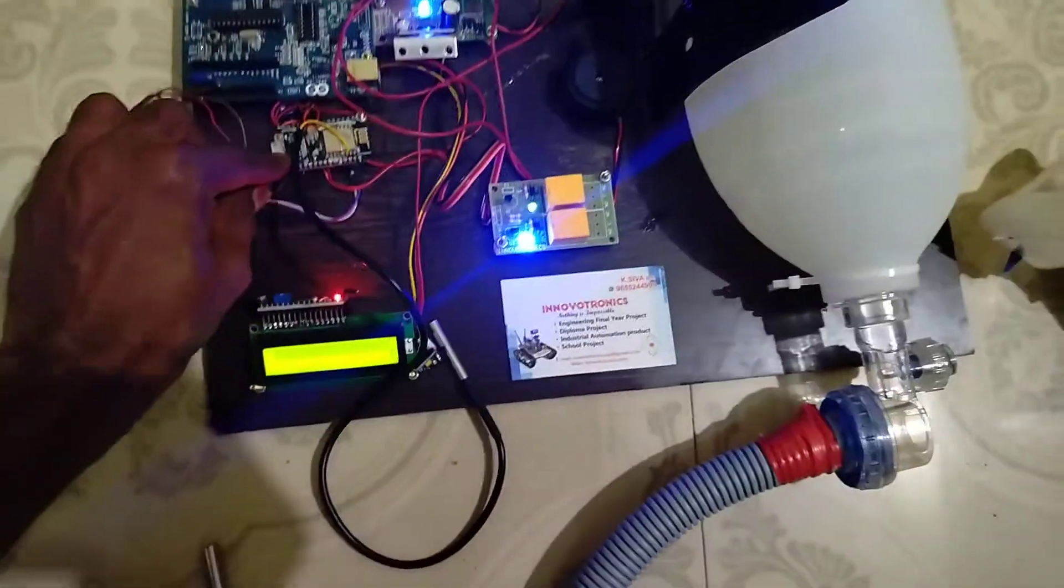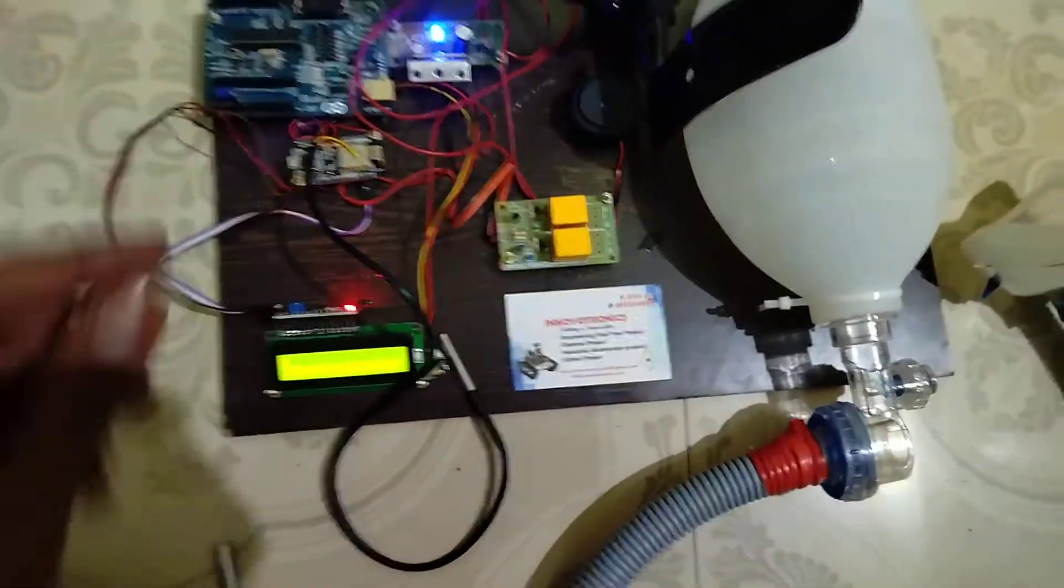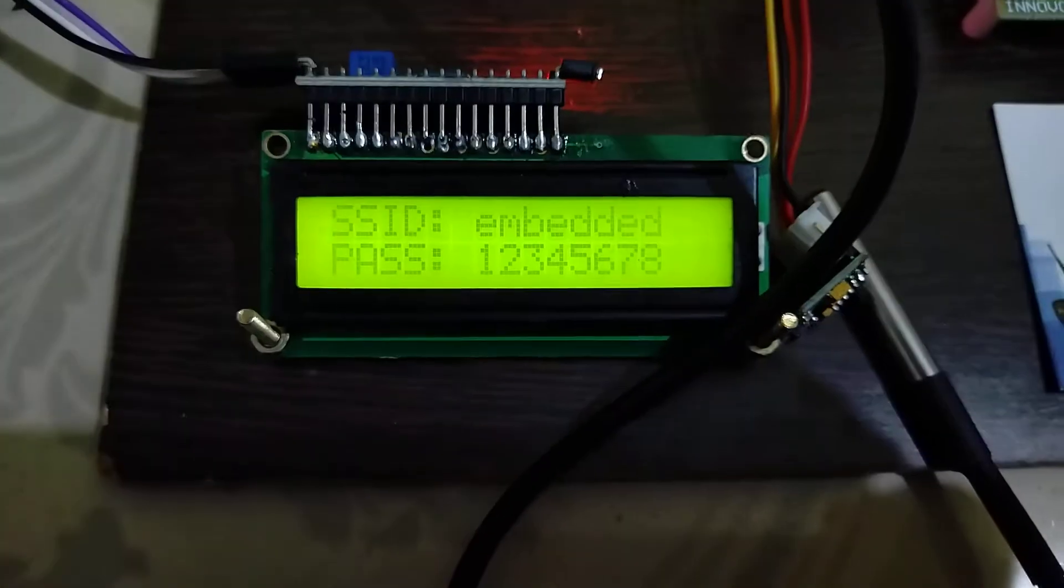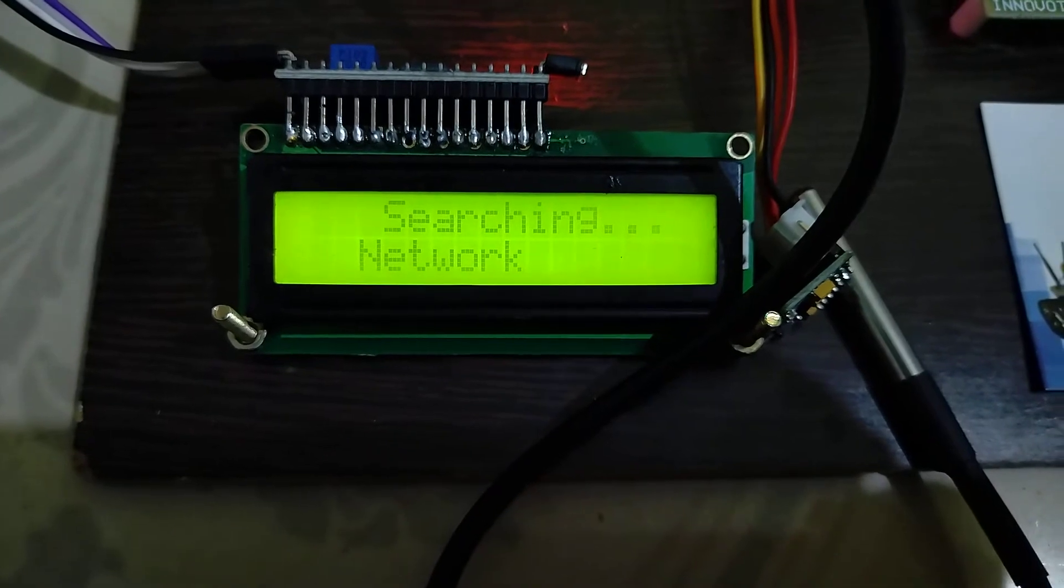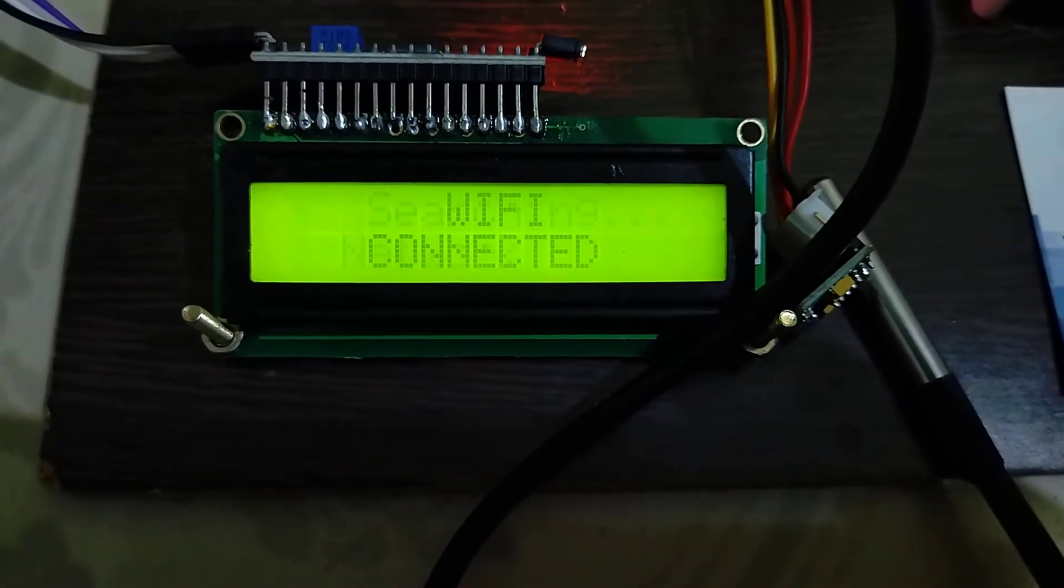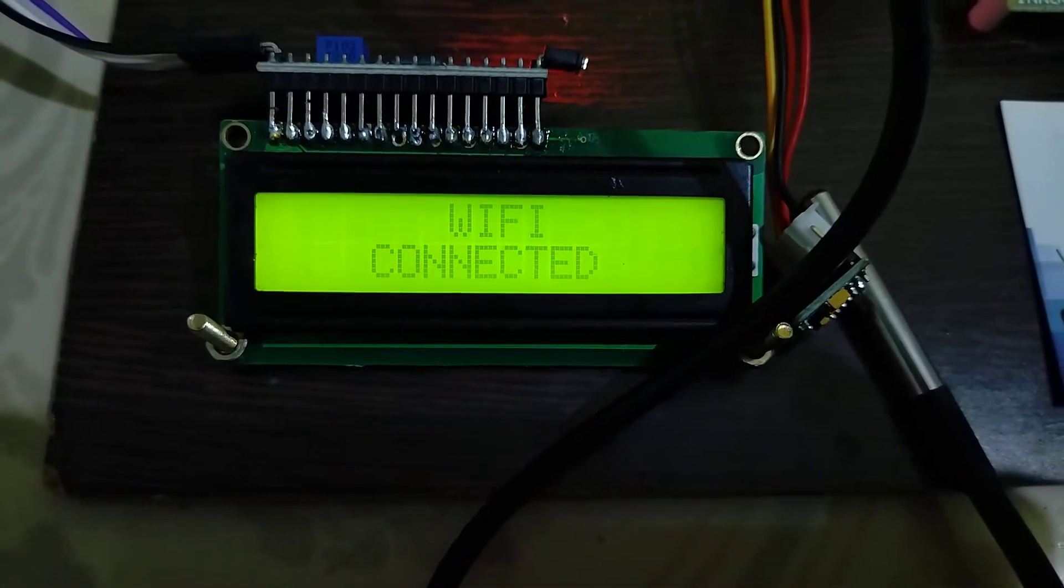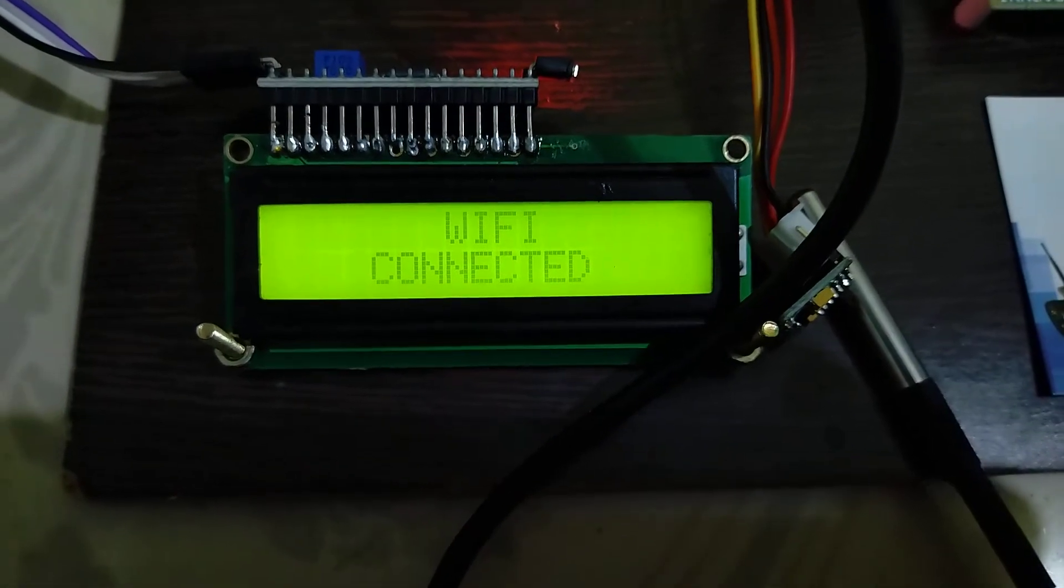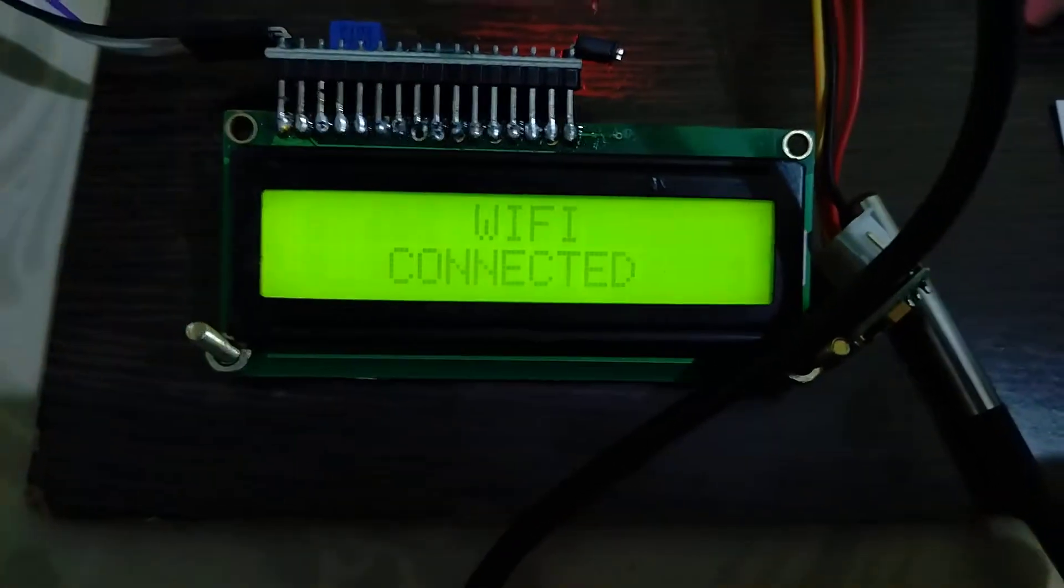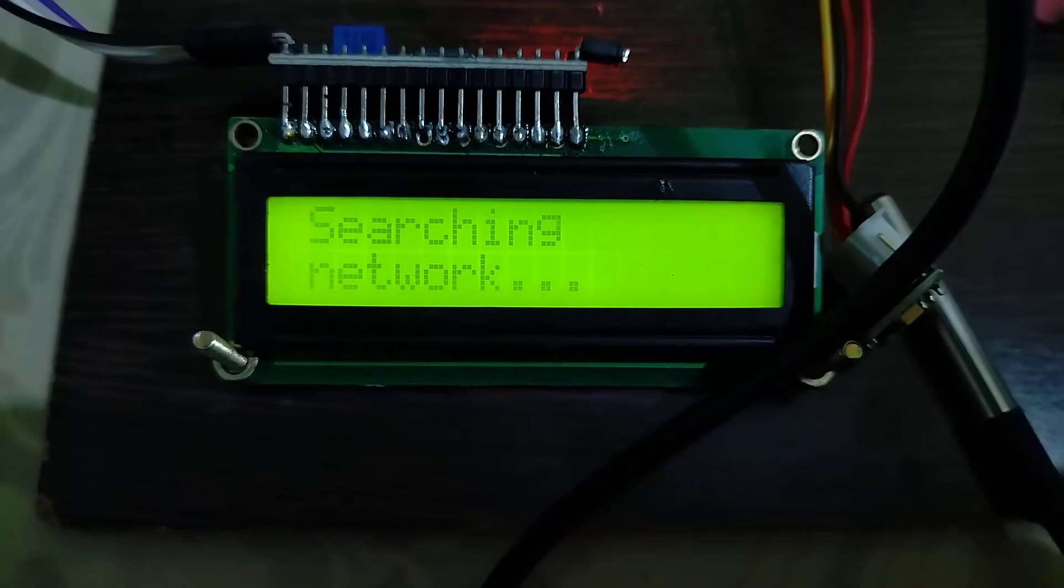Now power is turned on. You can see the display. When we turn on the display, it will automatically search for the Wi-Fi network. If the Wi-Fi network is available, it will automatically connect, which means we can monitor all the data through IoT.